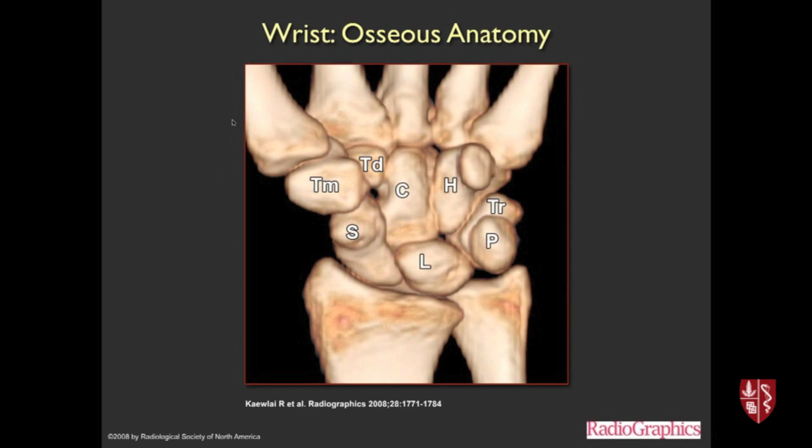I wanted to have kind of a synopsis package here because this is a complex topic with not only acute traumatic things, but chronic arthropathies and malalignment things that it's worth knowing something about. So I have a few more slides on the wrist than I did on the other joints.